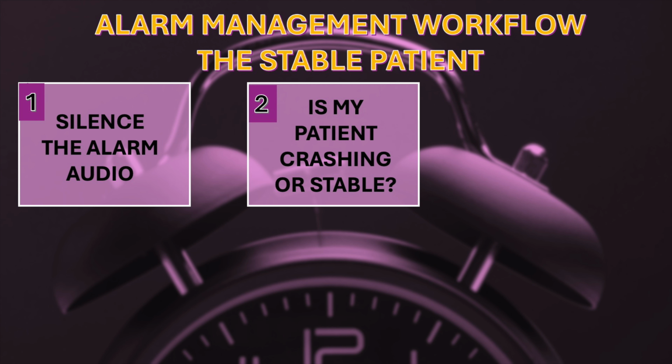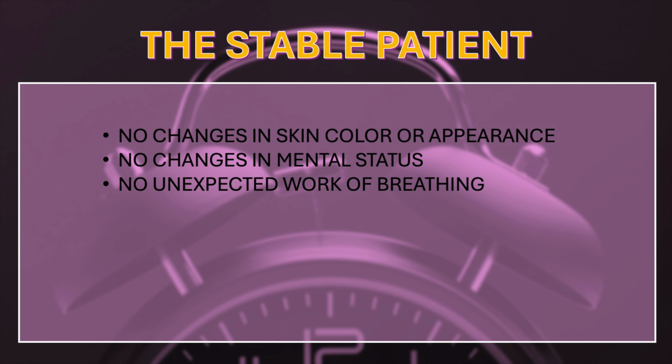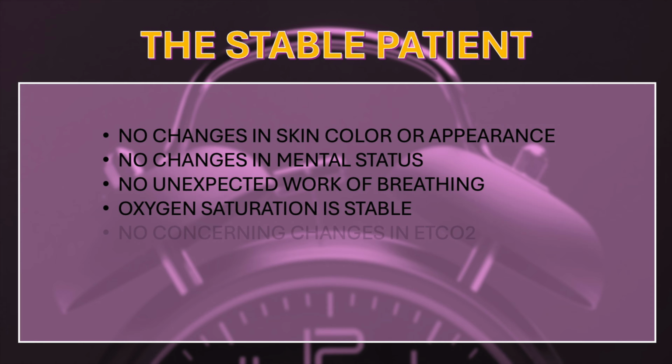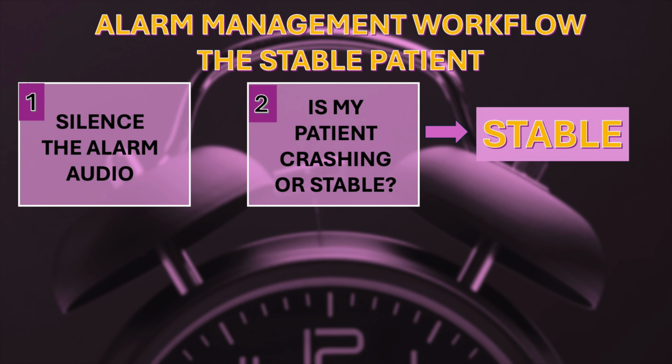Despite the alarms, your assessment shows no changes in the patient's skin color or mental status. The non-vented mask is not leaking, and the patient's breathing effort improves almost immediately. When you ask, "How are you feeling?" the patient responds with a thumbs up. The pulse ox, end tidal, heart rate, and hemodynamics are improving, confirming the patient's stability. Your patient on BiPAP remains stable despite the alarms.